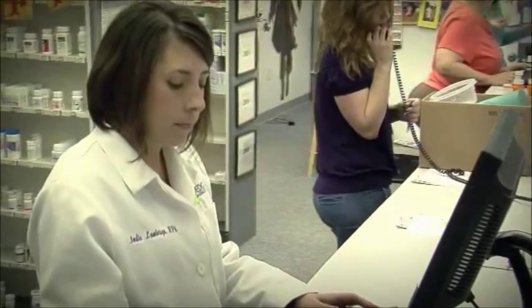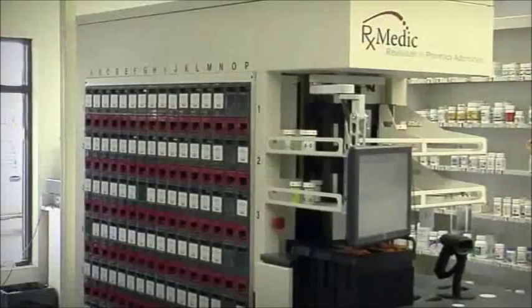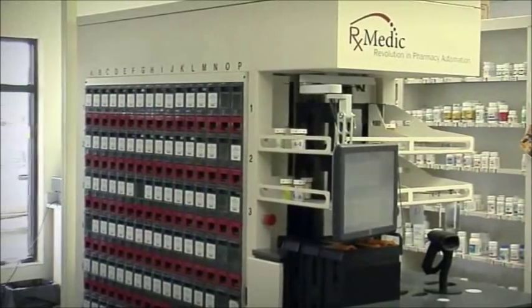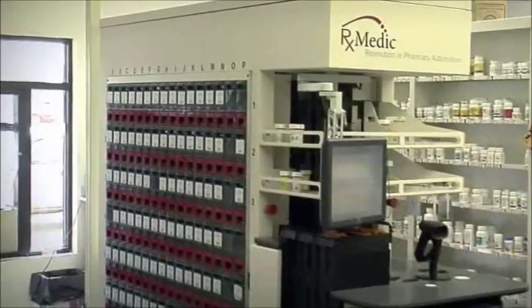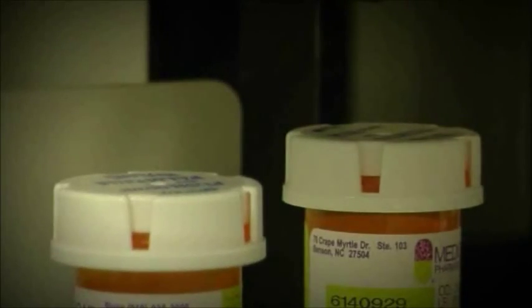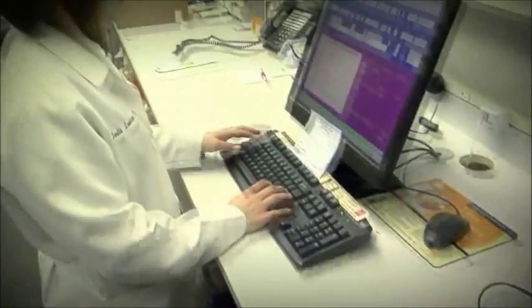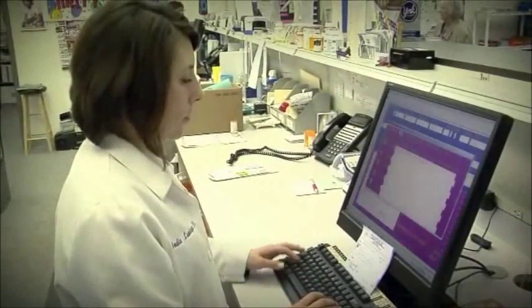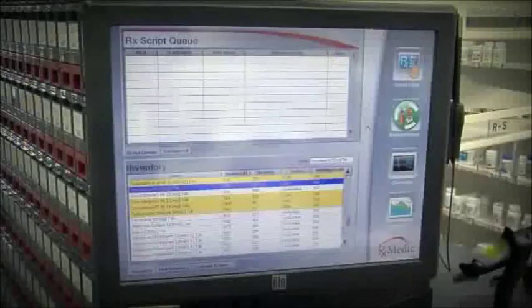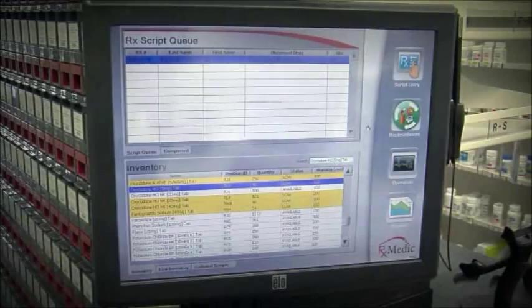To maximize time with your patients, let the RxMedic ADS fill prescriptions from your top 256 drugs. Simply enter the prescription information into your pharmacy management system and within seconds the script will automatically be sent to the RxMedic ADS.